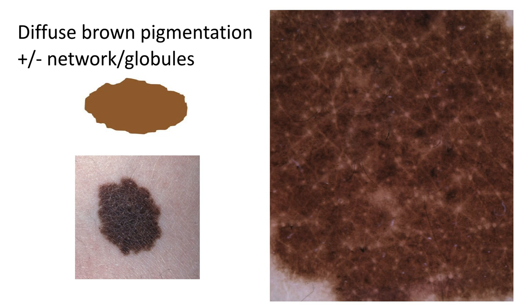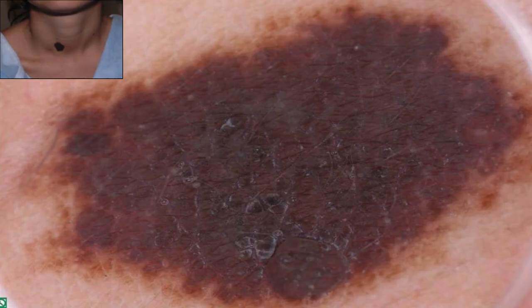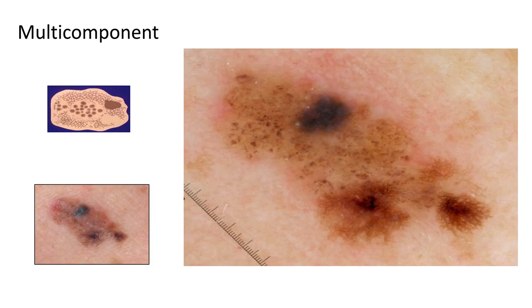The next pattern is diffuse brown structureless pigmentation. The predominance of the lesion will show structureless brown pigmentation, but you may see a few remnants of network or globules. In this example, there is predominantly structureless brown pigmentation with a few globules interspersed. Another example shows brown structureless pigmentation.